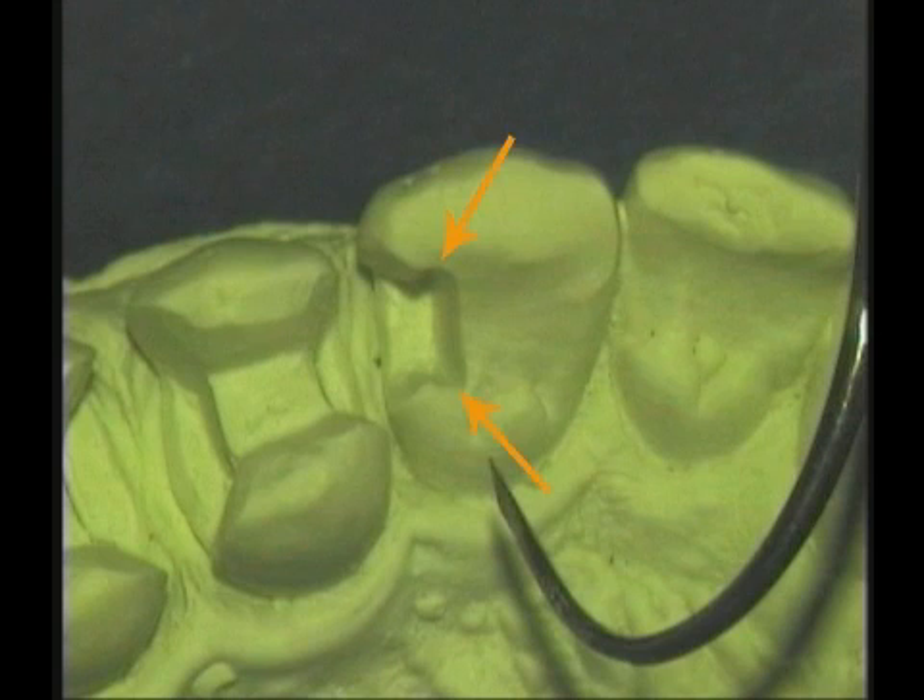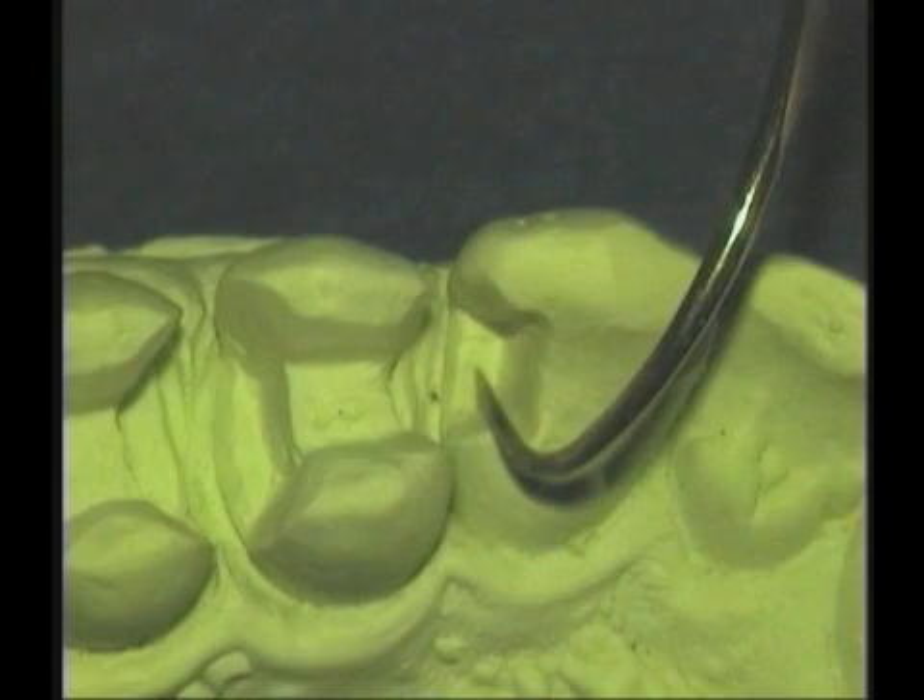You can see the retention form between these walls, and you can see the internal bevel on the gingival. Quite a nice outline.